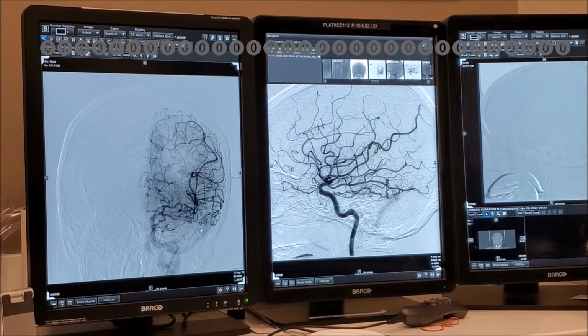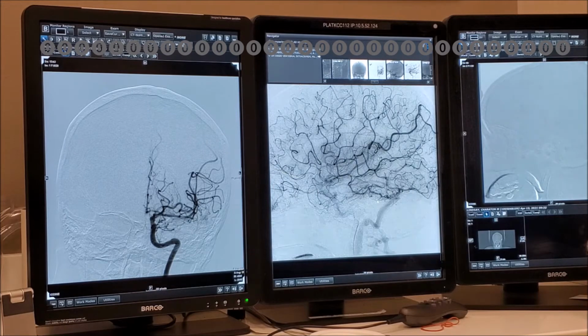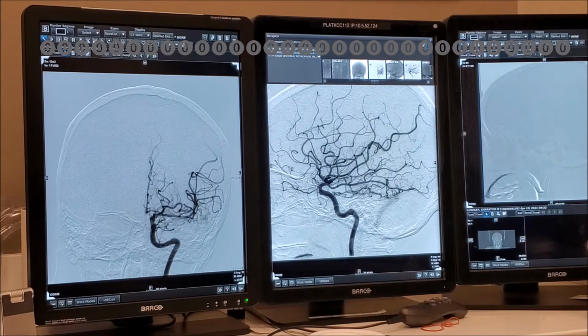But there is an interesting contribution, right? You see this network, right? Interesting. Because this probably is part of middle meningeal, whereas this is C5, but it's coming down like that. So this is basal tentorial. Remember we talked about the medial tentorial? Of course, it's a little bit dilated, not because it's behind the lesion. And now this artery, we've seen it before. Looks familiar. Where did we see it before?